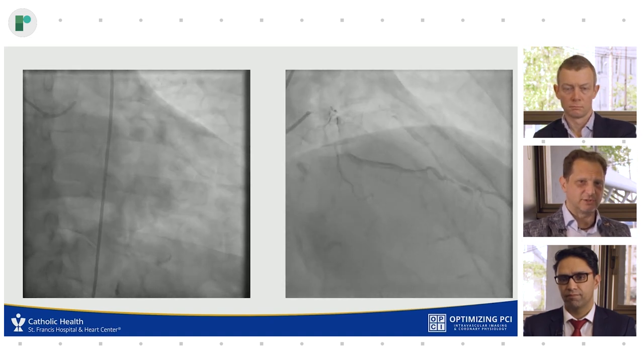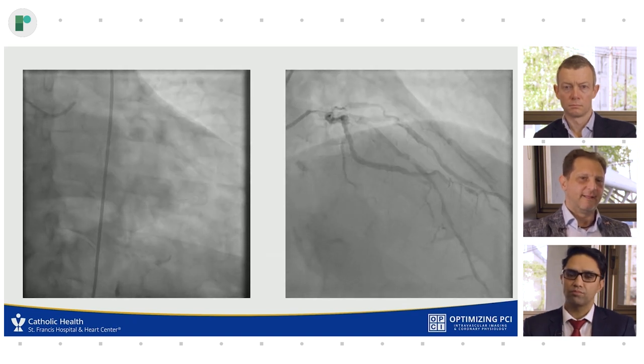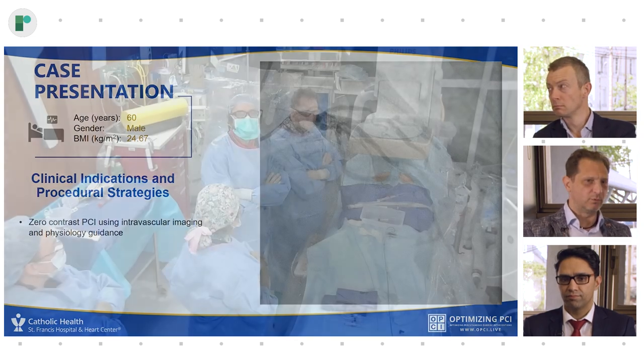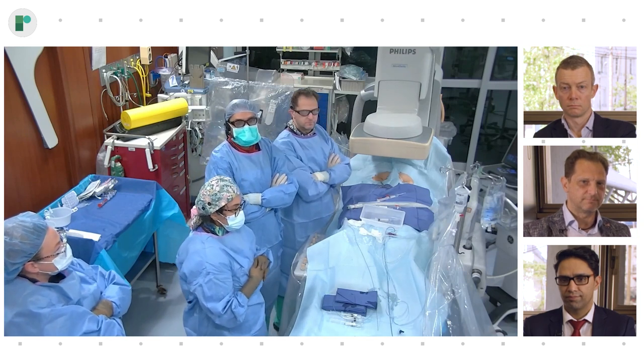So we decided not to treat that because we felt the focus was the mid LAD, and I think we used a total of, I don't know, 10 cc's or so of contrast for the diagnostic. What we usually do, unless it's an emergency, is take the patient off the table, make sure the renal function is stable, and bring them back 2 weeks later, and here we are now doing the case.